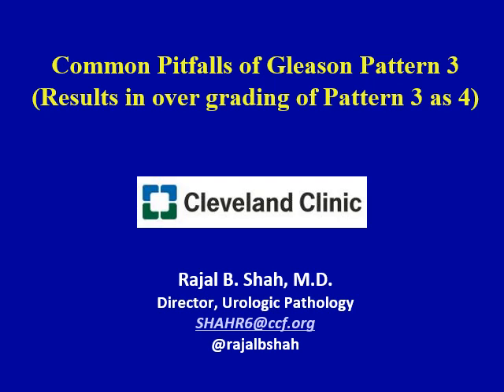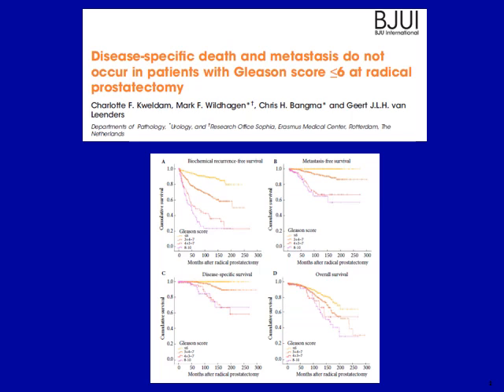In my experience in contemporary prostate biopsy practice, I think we are seeing more problems with the overgrading of prostate cancer compared to undergrading — specifically overgrading of pattern 3 as 4. The important reason is that we now know that patients with pure Gleason pattern 3 at radical prostatectomy have an indolent disease; disease-specific death and metastasis do not occur. So the distinction of pattern 3 from pattern 4, in the era of active surveillance management for prostate cancer, has become especially critical.